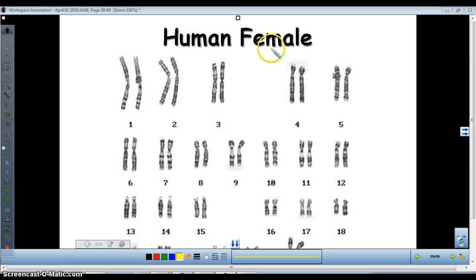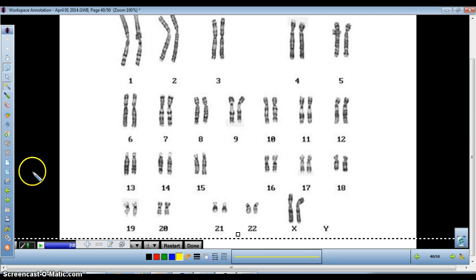Now let's look here. What do we have? We are looking at a human female. How do you know? You know by looking again at the sex chromosomes. Here we have two X's, and remember that two X's equals female.